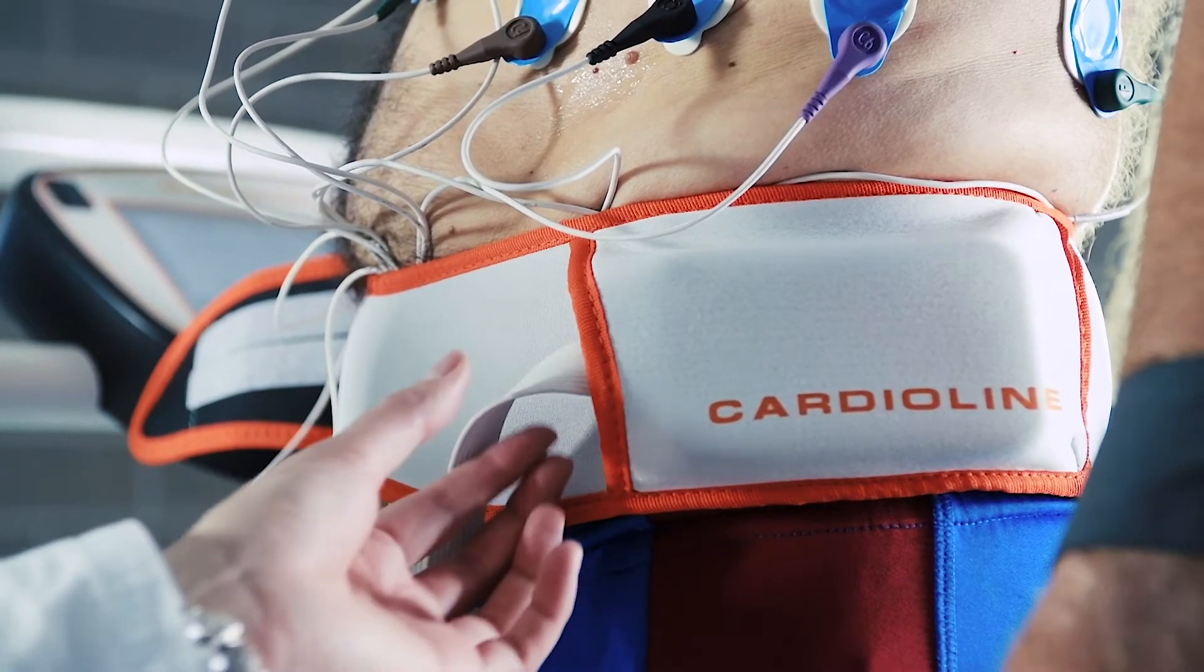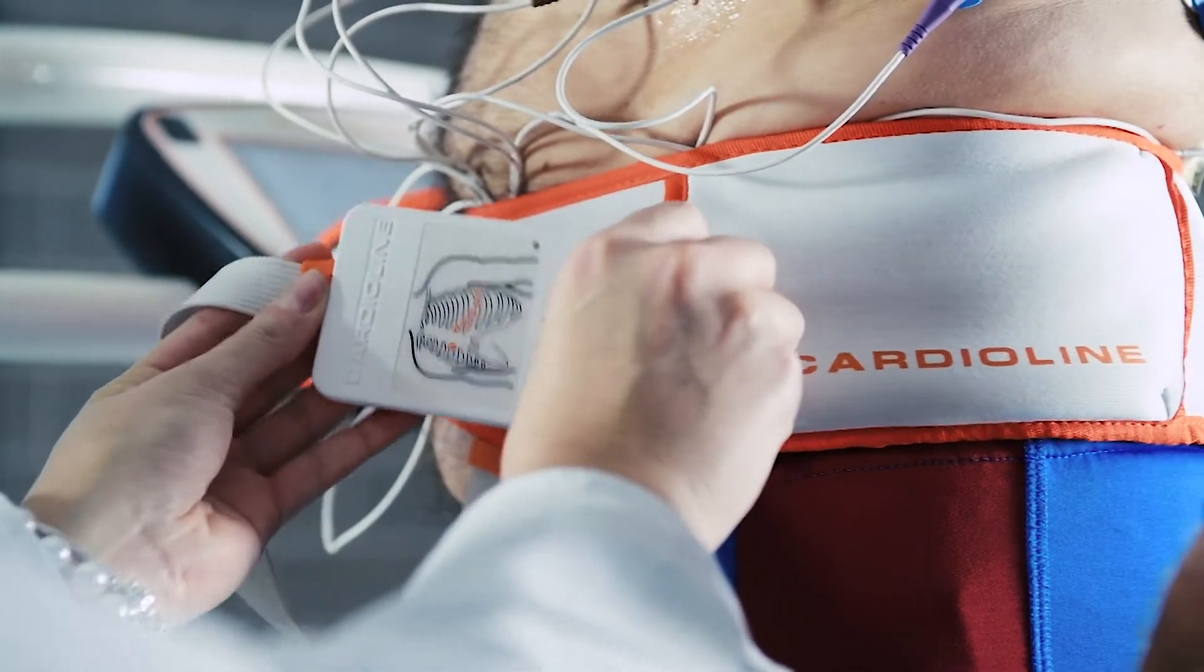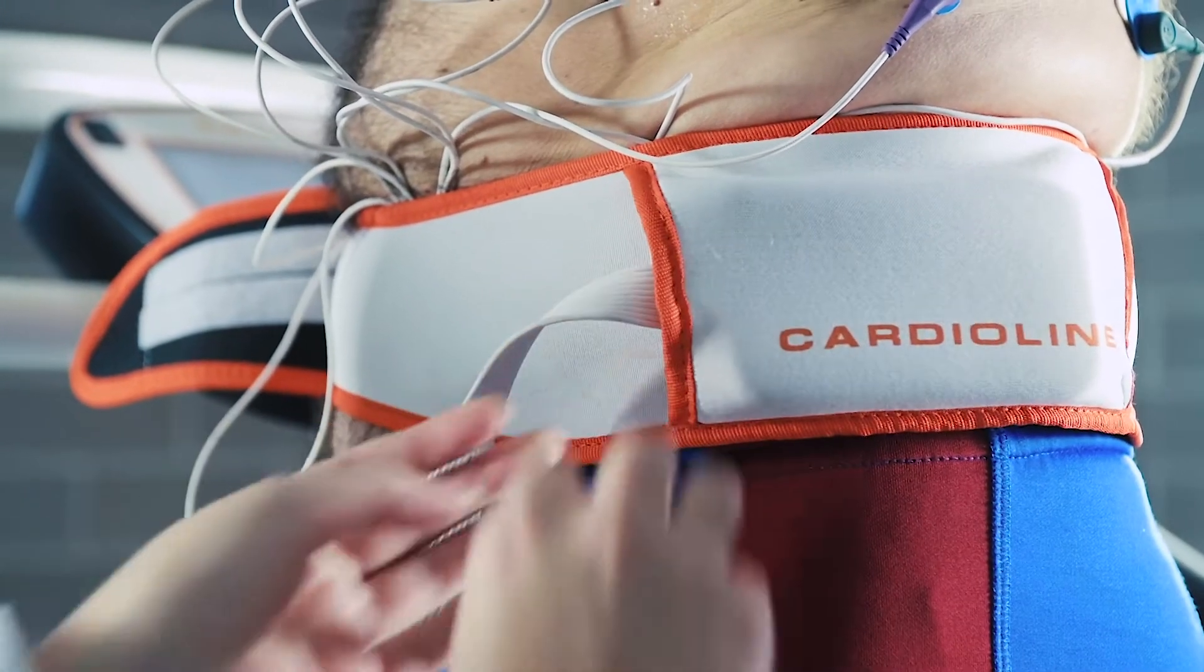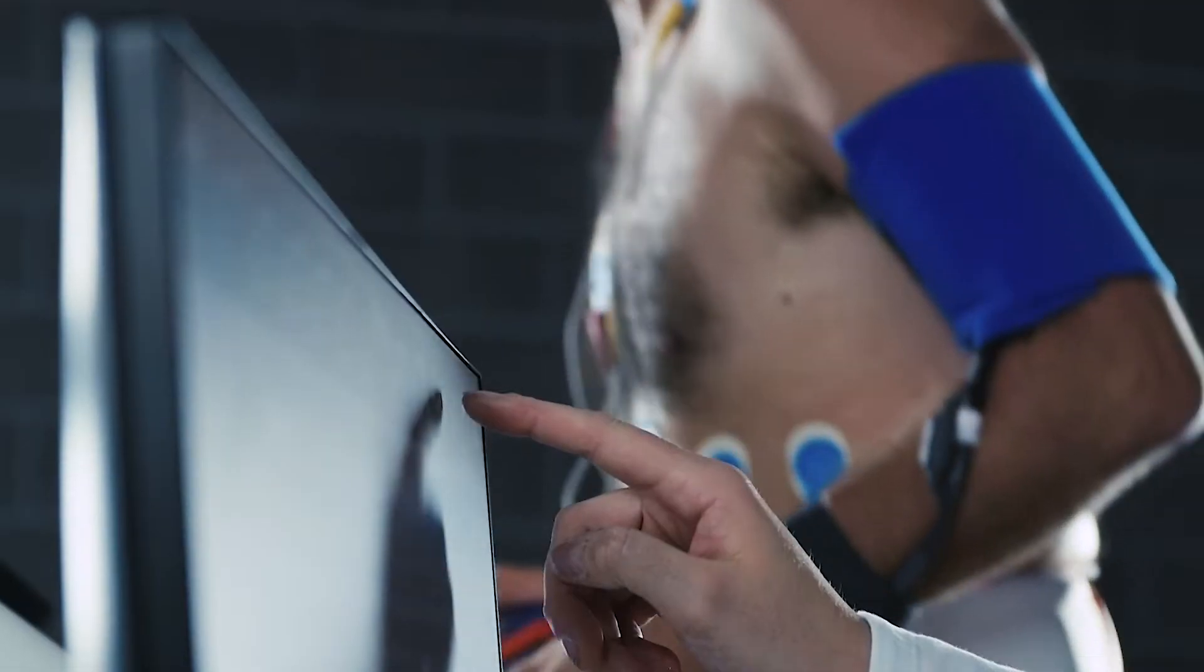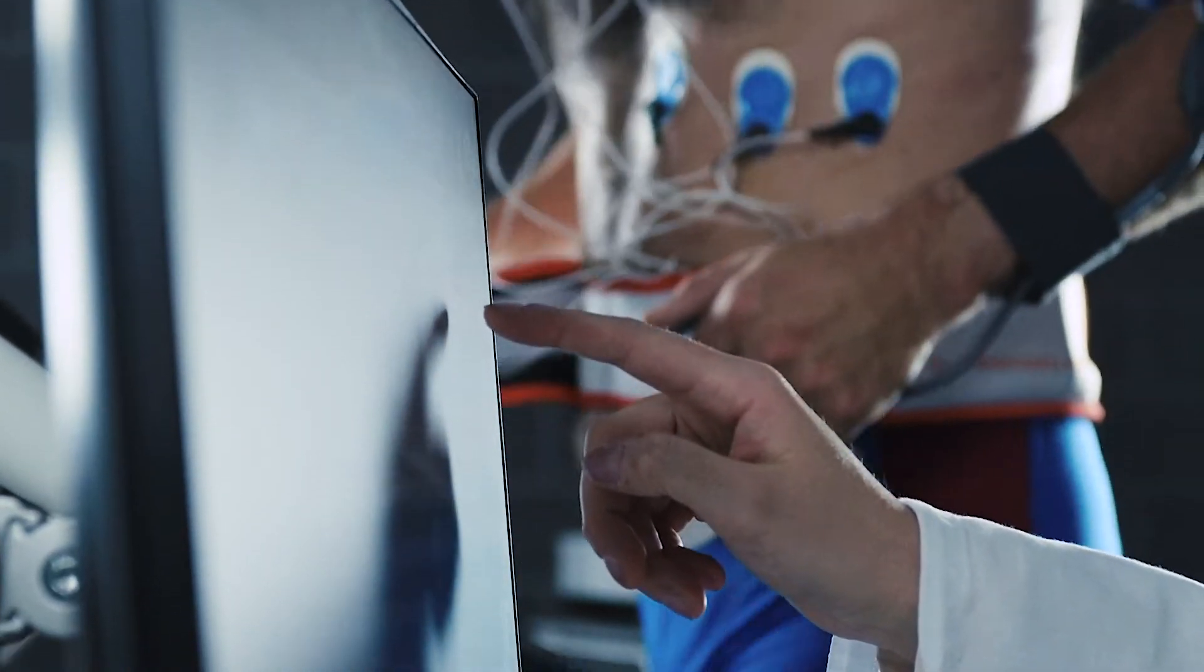The HD Plus is the wireless acquisition module used in the Cube Stress. Its lightness and portability increases patient comfort and mobility on treadmill, bicycle, or while reclining for echo-stress procedures.